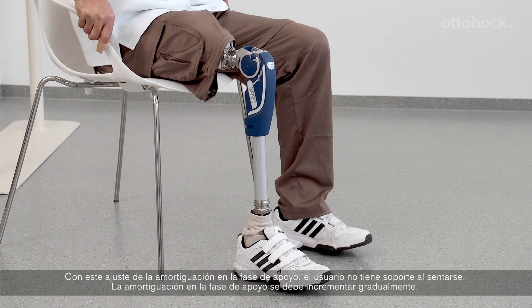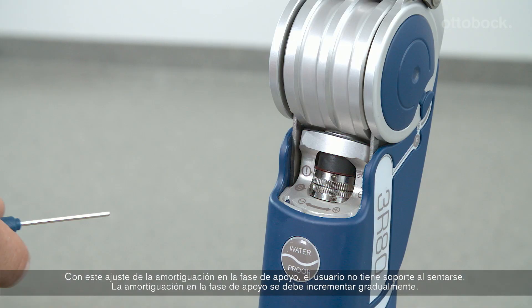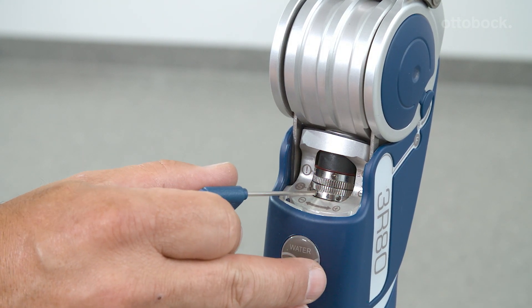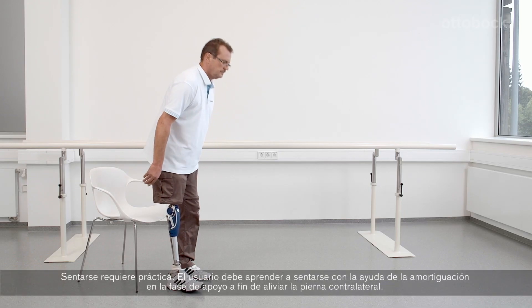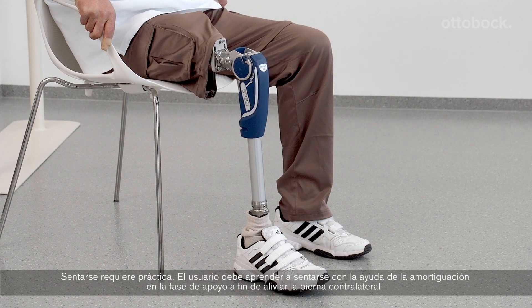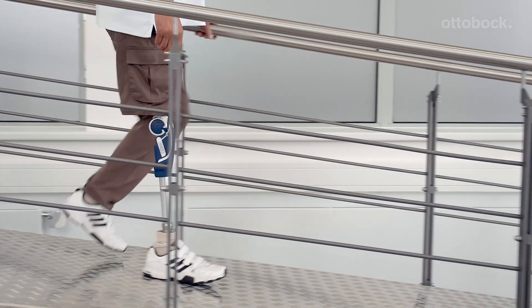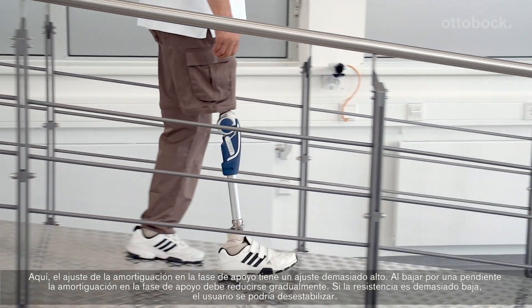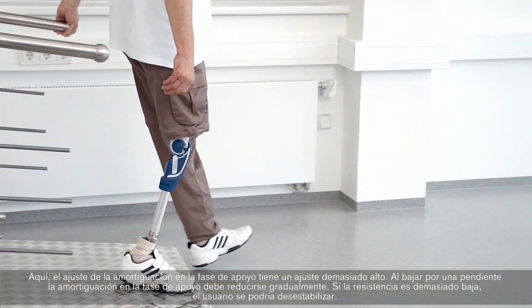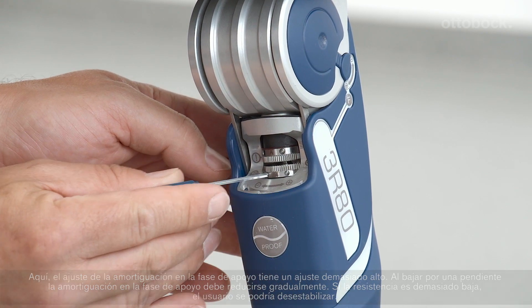With this setting of the stance phase damping, the user has no support when sitting down. The stance phase damping should be increased gradually. Sitting down needs to be practiced; the user needs to learn to sit down with the help of the stance phase damping to relieve the contralateral leg. When walking down a ramp, the stance phase damping needs to be gradually decreased. If the resistance is too low, the user could become unstable.